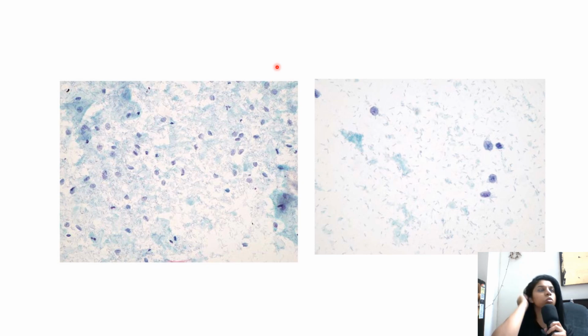So this is a patient with adenomyosis and menorrhagia. The menorrhagia is explained by the adenomyosis itself. So there is nothing very specific about the history that we have to be getting in the pap smear other than the fact that the patient is in secretory phase. So now what are we seeing?